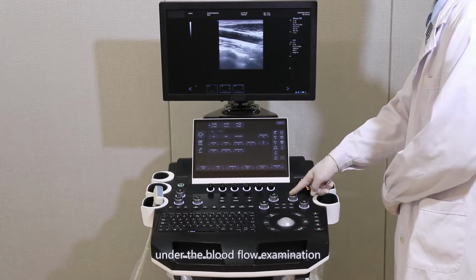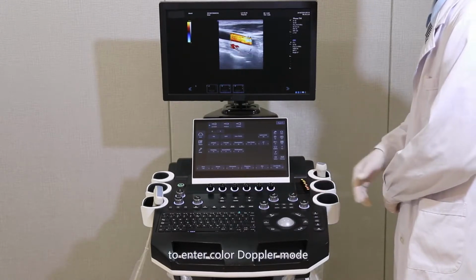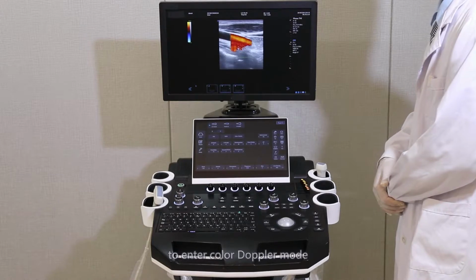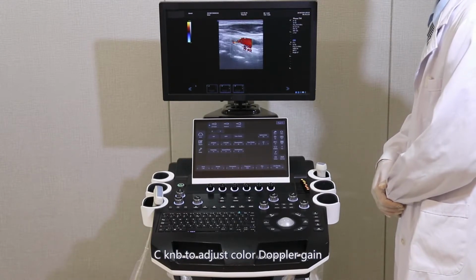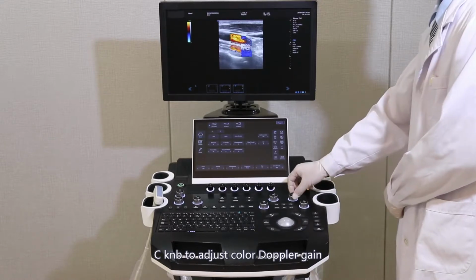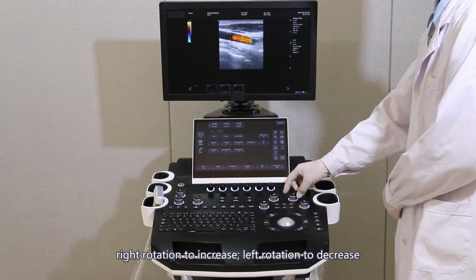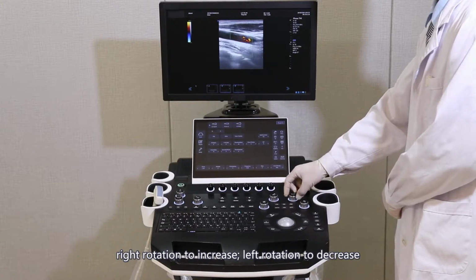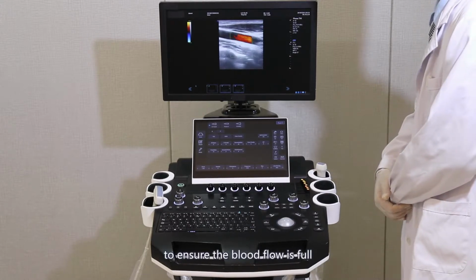On the blood flow examination, press the C knob to enter color Doppler mode. Rotate the C knob to adjust color Doppler gain. Right rotation to increase, left rotation to decrease, to ensure the blood flow is full.